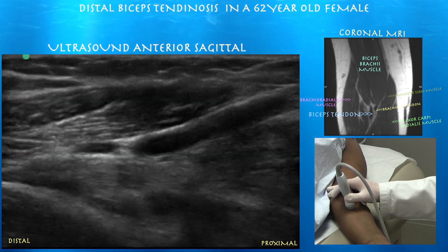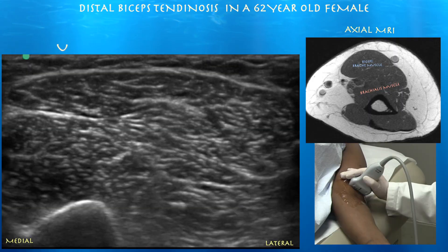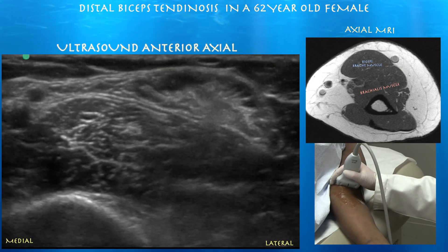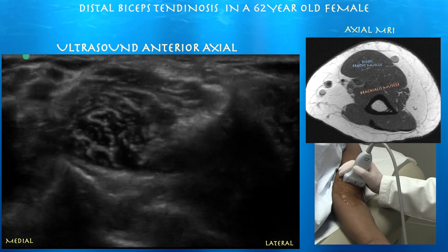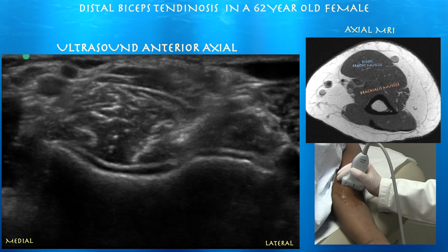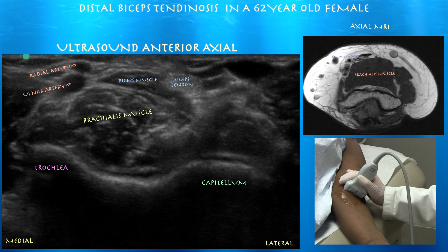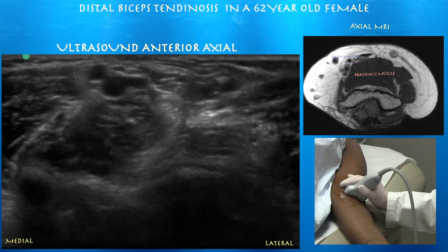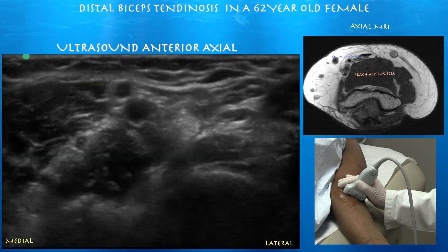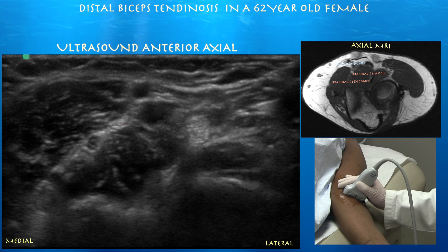As we move the probe in different directions we can see how the brachial artery is branching off into the radial and ulnar arteries — on the right side of the screen is radial, the medial side is ulnar. We've got the biceps tendon right on top, and following it down it converges into our biceps tendon. Here you can see the biceps tendon with some residual biceps muscle around it, and I believe there is a high division of the brachial artery here into the radial and ulnar arteries.